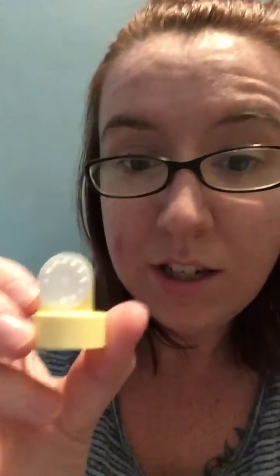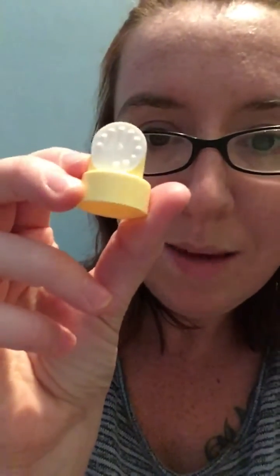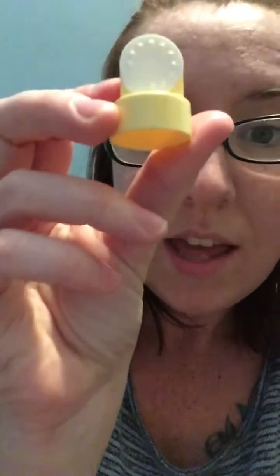Inside of this plastic connector piece, it connects on right there, is this little yellow valve. Okay? When you are putting your pump together, you'll need to make sure that this yellow valve is on here, and you need to make sure that this little white piece is also on there. That little white piece is called a membrane, and it's actually one of the most important factors of suction on your pump. So if this is not connected to the yellow valve, your pump is not going to work. And if it's not pushed in all the way, your pump is not going to work.